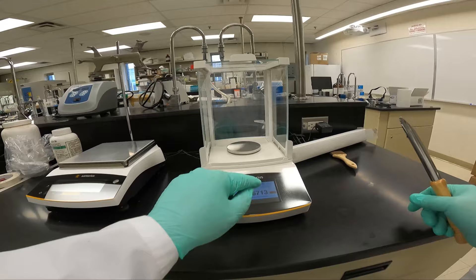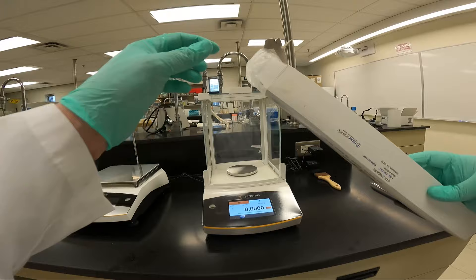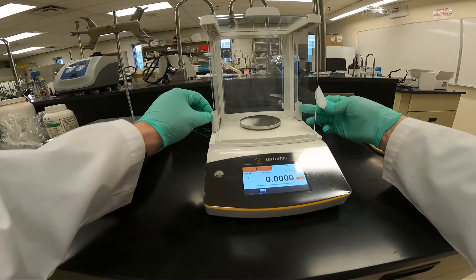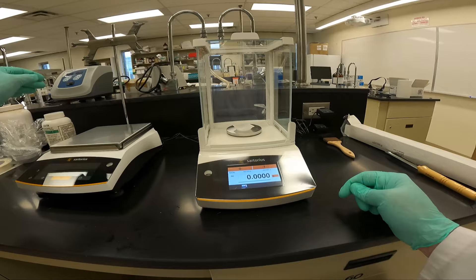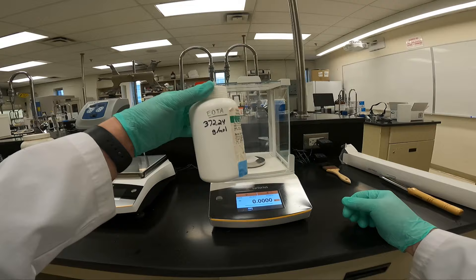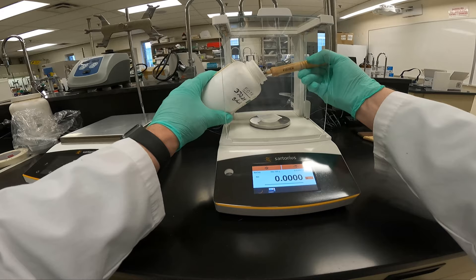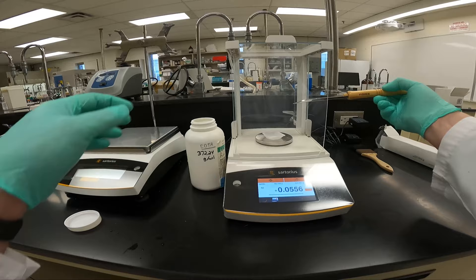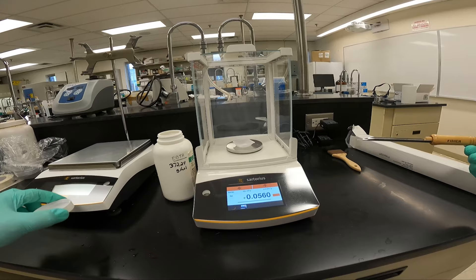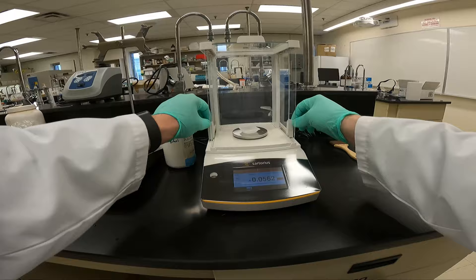We are going to measure out 0.0558 grams. We tear the balance. Here is our EDTA — that is a very large molar mass. We are going to be making up a 1 millimolar solution in our PBS. Why don't we use water to make this up? Well, if I add water directly to my cells, the cells would be in a hypotonic state, water would flow into the cells, and the cells would lyse. As a result, we can never add just pure water to the cells. I am almost right on first try — a lucky day in the lab.